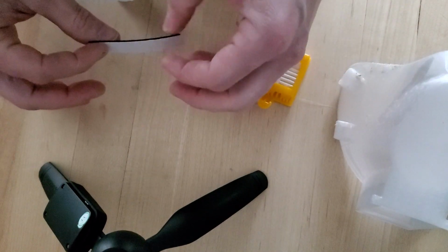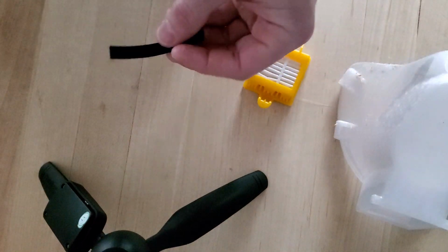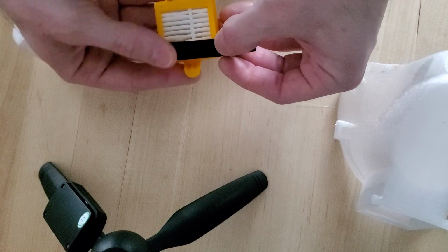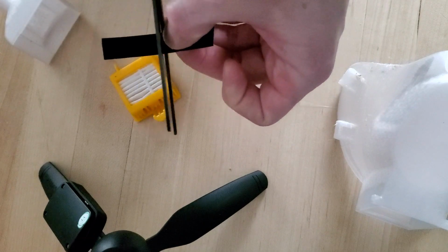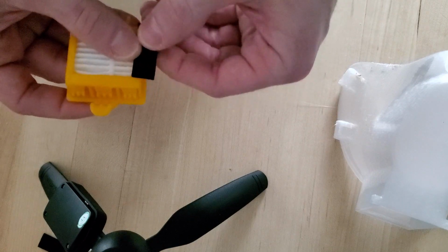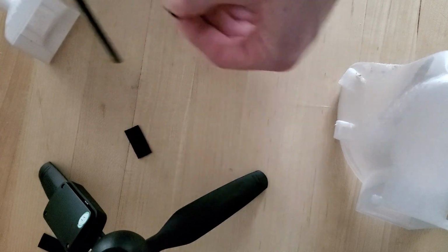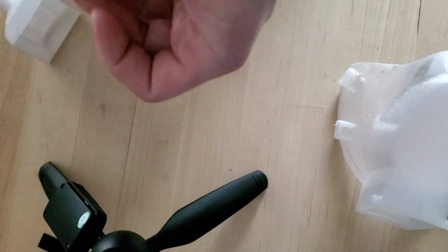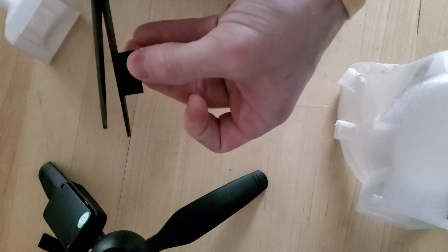So I've taken a piece of 1/8 or 1/16 inch foam tape, okay, and pretty straightforward. I'm going to cut one piece that is about the length of this top, and then one piece that is about the length of the side. Okay, so this piece, and maybe just a little bit shorter. Okay, now let's cut that in half.